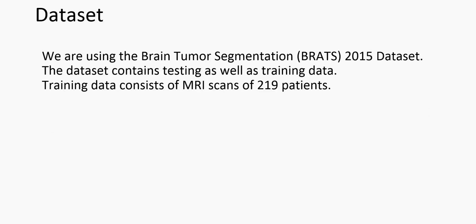We obtained our training data from BRATS competition. BRATS basically stands for Brain Tumor Segmentation, and it's a competition held every year that aims at building autonomous system to predict brain tumor. We had 219 patients data, out of which we used 165 for training purposes and the rest 54 for testing purposes.